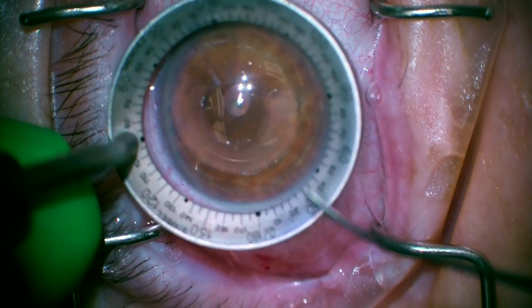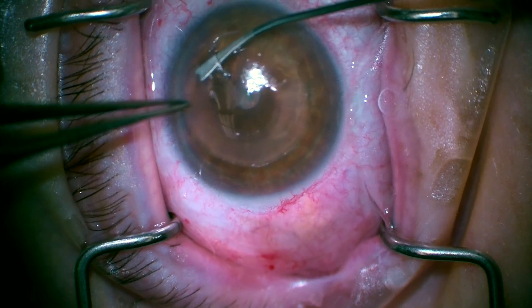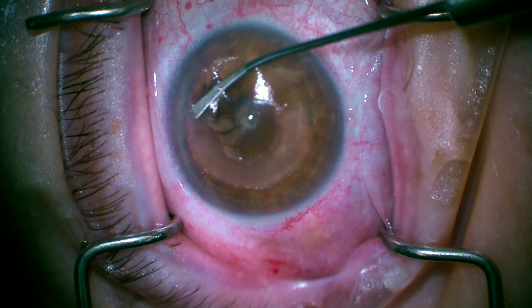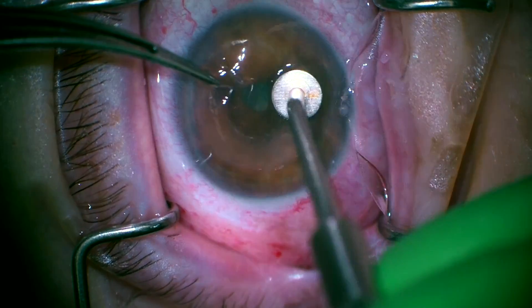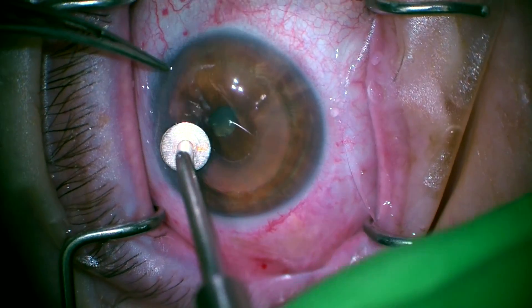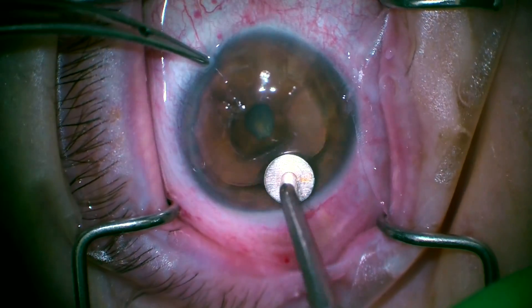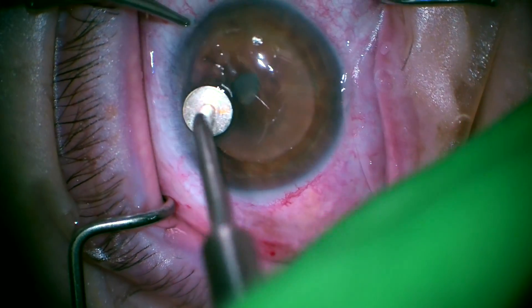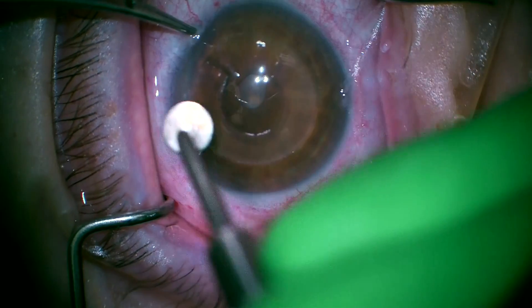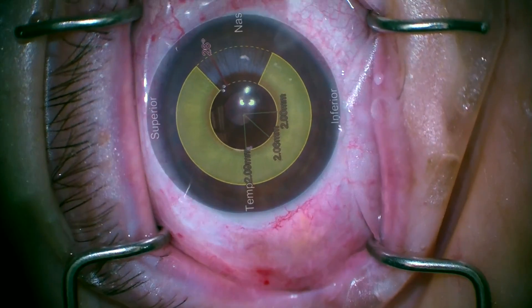Here you can see we've got the segment all the way in, and I'm just confirming it's in the right location by matching it to the map sent by Corneagen. Now this is a specially-made device for CTAC that goes into the channel and gently convinces the CTAC segment to advance along the channel. Then we'll use a little Kiro ball — similar to what we used in LASIK but slightly larger — to iron out the CTAC segment, convincing it to go all the way around the channels created by the femtosecond laser. We'll use the smoothing device to make sure we've put that CTAC insert right where it belongs, and I'll show you the overlay of the surgical plan to confirm the segment is exactly where we want it to be.